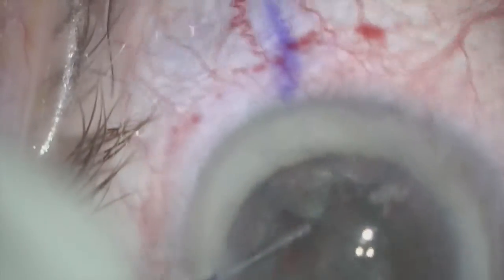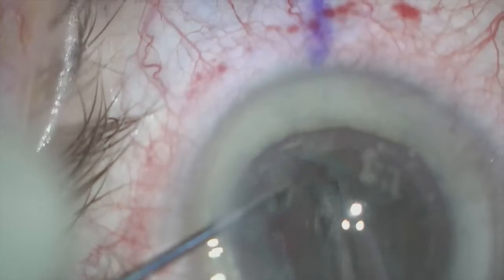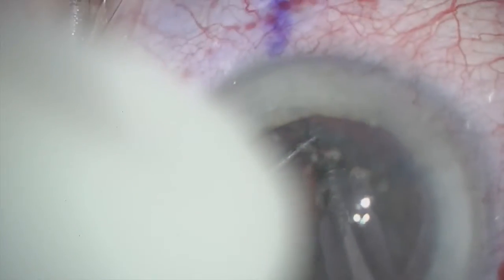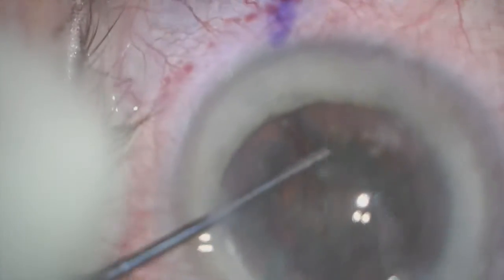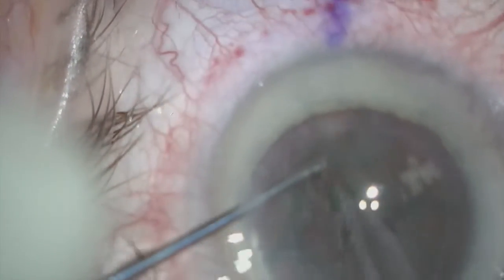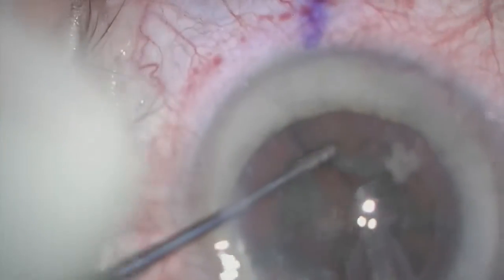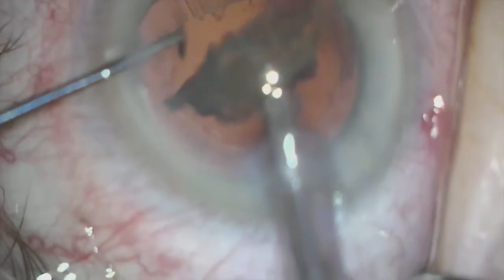At no point in time was the posterior capsule or anterior capsule violated during this case. And no zonular laxity was noted throughout. The lens spins very freely and was removed quite nicely without any problem.